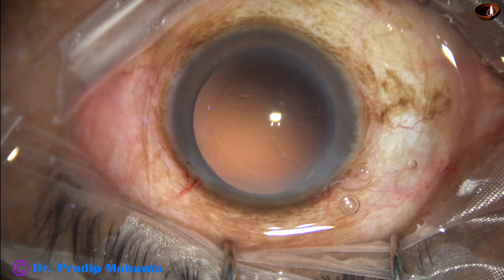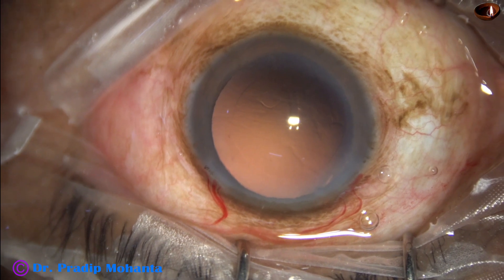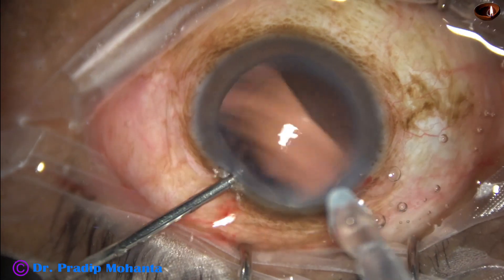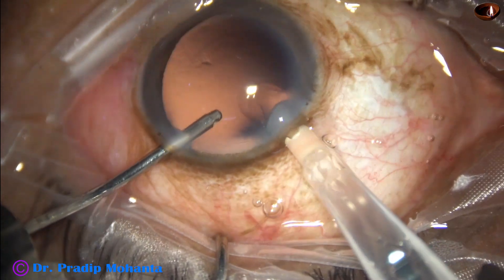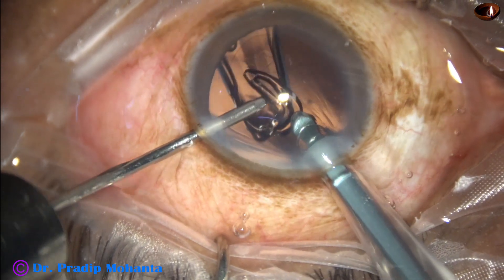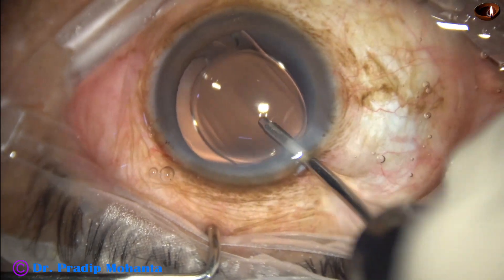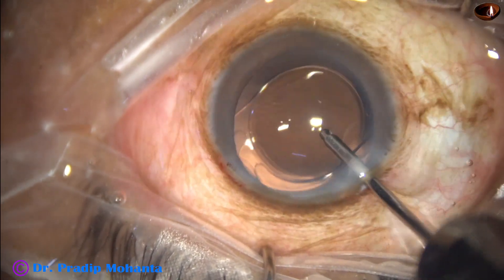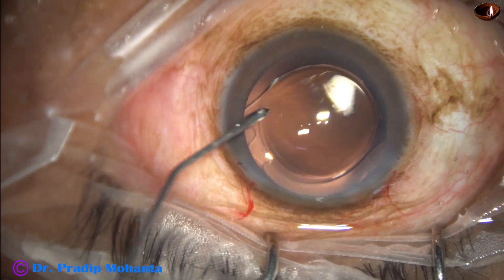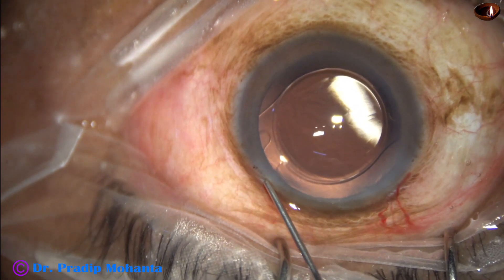After cleaning the posterior capsule, hydroimplantation of a single-piece monofocal aspheric intraocular lens is performed in the capsular bag. The capsular bag and the anterior chamber are irrigated with moxifloxacin, and the side port is closed by stromal hydration.